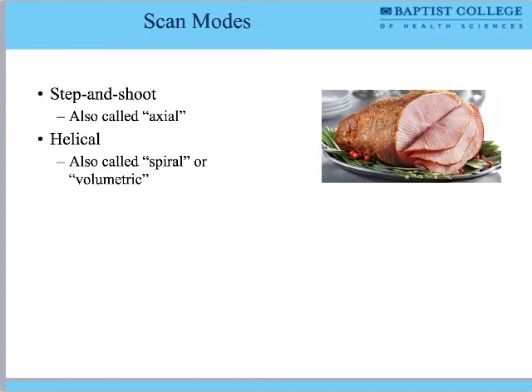There's two different ways, yes? Sorry. So the volume average, does that come from the raw data, or is that the image data? That's a good question. The numeric value that it gets assigned, there's going to be a lot more averaging on the image data than on the raw data. The raw data is really just kind of, this is what happened at the image receptor. So then you could probably assume that the numeric averaging that takes place is with the imaging data. Correct.